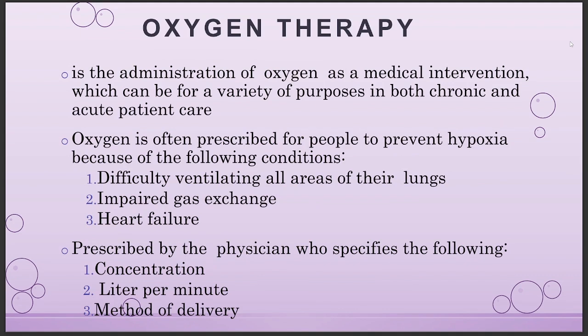First of all, what is oxygen therapy? It is the administration of oxygen as a medical intervention which can be for a variety of purposes in both chronic and acute patient care. Oxygen is often prescribed for people to prevent hypoxia because of the following conditions: difficulty ventilating all areas of their lungs, impaired gas exchange, heart failure, etc.